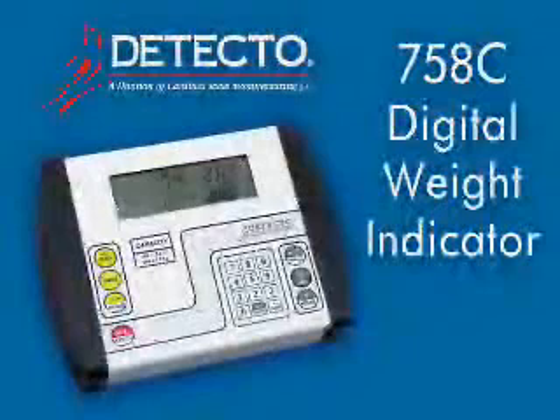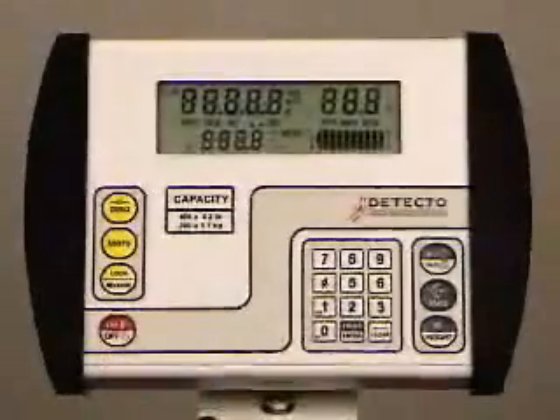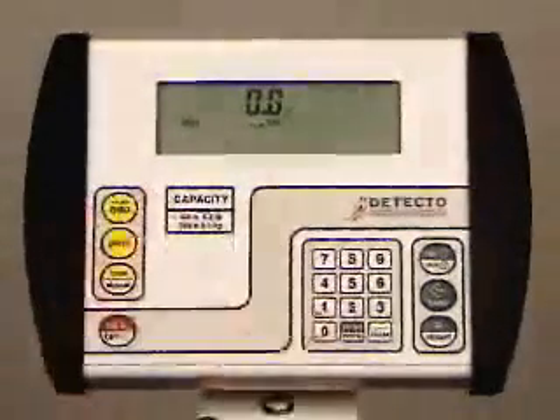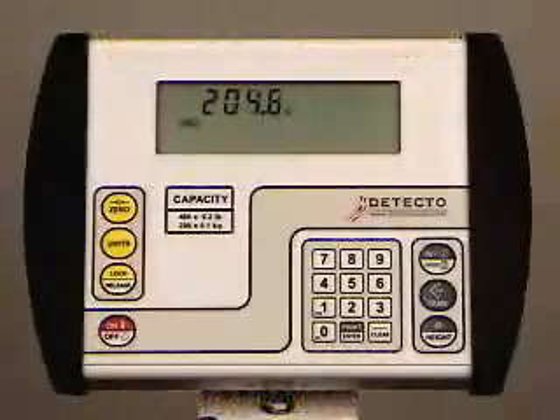Detecto's Digital Healthcare Scales feature the 758C Weight Indicator, a precision full-featured instrument with selectable units, automatic display lock, push-button and keypad tare, selectable key lockout, ID storage, and serial connectivity. This video will explain these functions and show you why the 758C indicator is the perfect choice for scales in hospitals, doctor's offices, weight loss clinics, long-term care facilities, or anywhere accurate weight is required. One of the great features of the 758C is that with all of its incredibly diverse functions, it can also be used very easily for basic weighing without any learning curve. To begin, turn the power on, making sure the scale platform is clear. The 758C indicator will go through its opening sequence and will power up to zero if that function is enabled. If it does not power up to zero, simply push the zero key. The yellow quick keys on the left side of the 758C provide fast, easy operation even by first-time users — these may be all that you need for basic weighing and are highlighted in yellow to find easily.